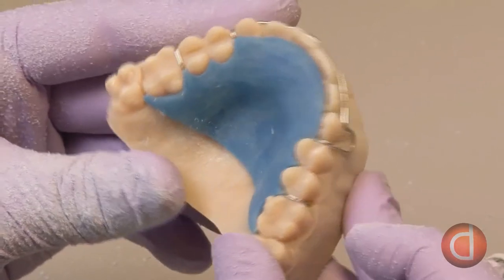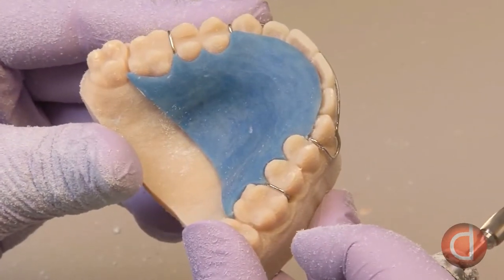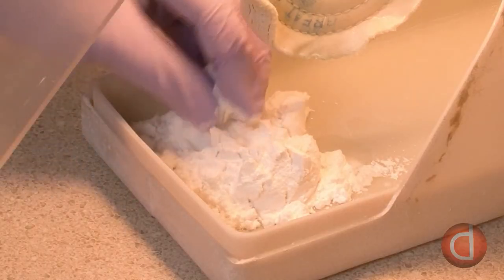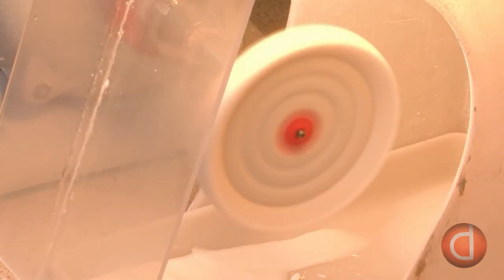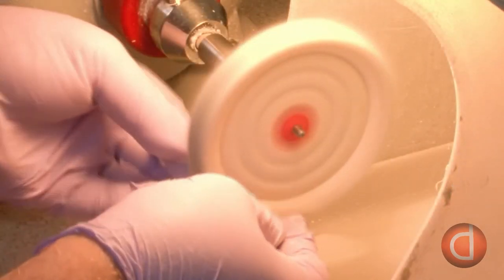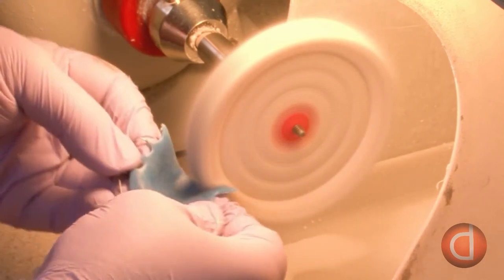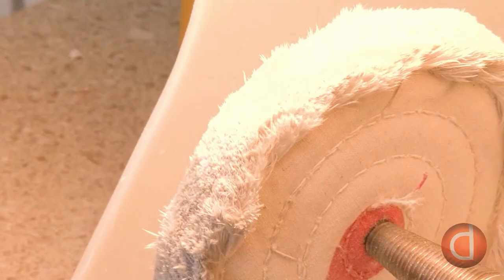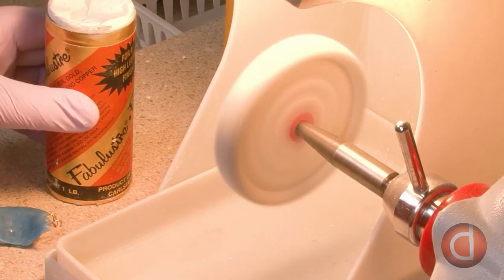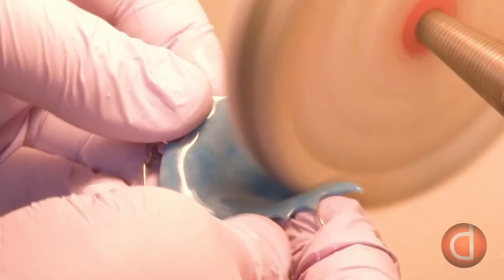The next step is to smooth out the acrylic using a powdered abrasive known as pumice in conjunction with a muslin rag wheel. Water is added to the pumice to make a paste, which is applied to the retainer and run under the rag wheel until the surface is smooth and glossy. He then adds a greaseless polishing compound to another muslin rag wheel and polishes the acrylic to a high shine.